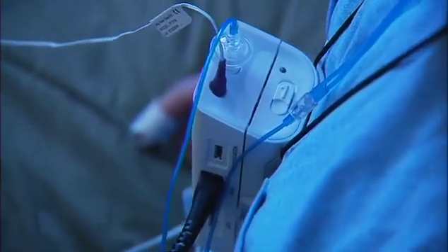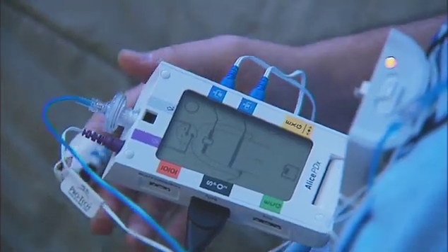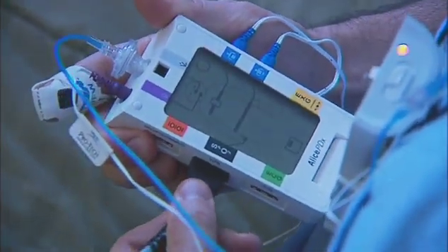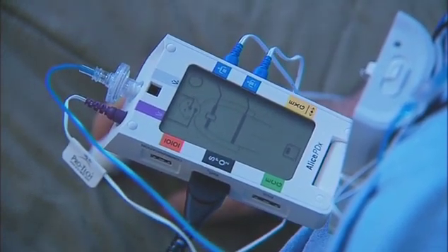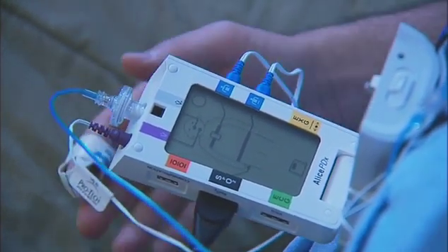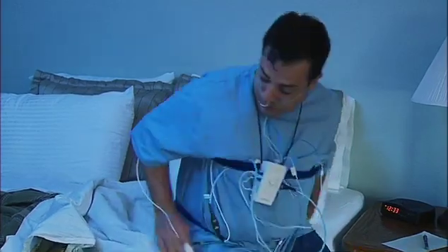If a sensor connector becomes detached during the night, a yellow light located near the open/close latch will flash. Open the device and you will see the corresponding connection indicator on the display flashing to indicate which sensor is loose. It is important to reconnect the loose wire. Once connected, the flashing will stop — close the device and make sure to press the front button once.